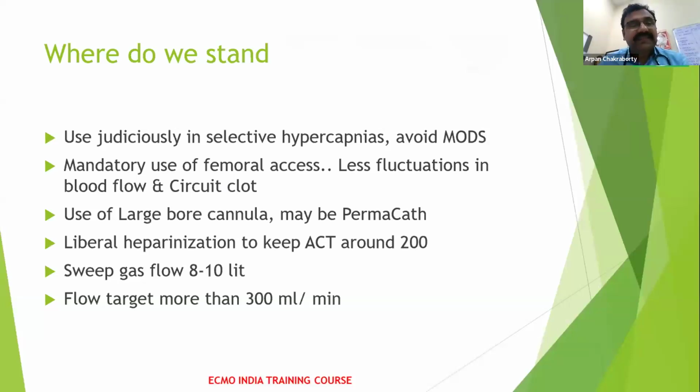Now, where do we stand on practicing ECOR? All of you can practice ECOR because it needs a dialysis machine only, and a very good knowledge of ECMO is not required. But my suggestion, after using a lot of ECOR in practice, is to use it judiciously in selective hypercapnias and avoid MODS, because you might achieve the primary goal, but the outcome might not be very good in MODS patients. So in selective hypercapnias, you can use ECOR.